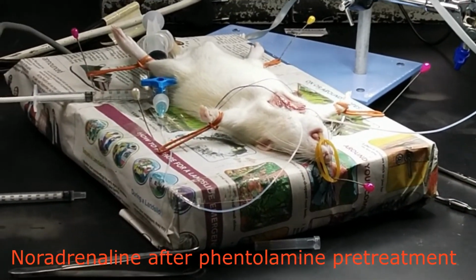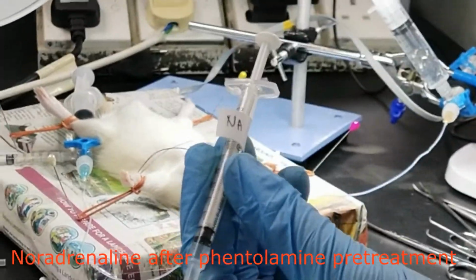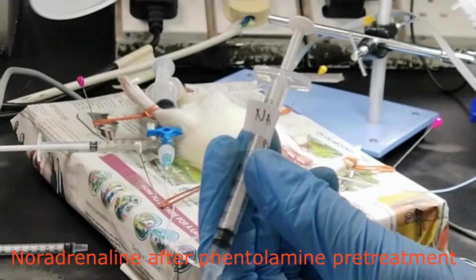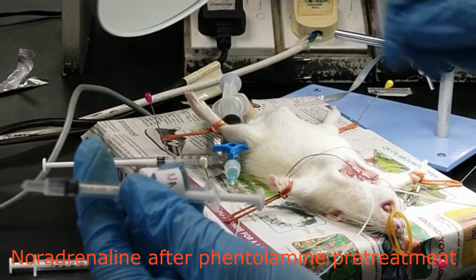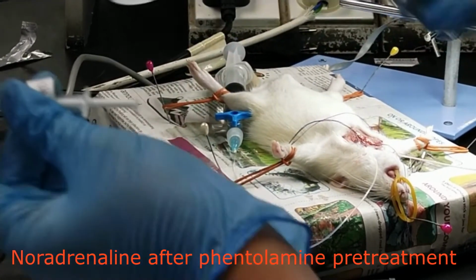Next, we're going to proceed with the post-treatment by using the NA, noradrenaline. Okay, so we are using 0.3 microgram per kg, the dosage for the NA. So we're going to inject NA into the system, followed by 0.5 ml of normal saline.